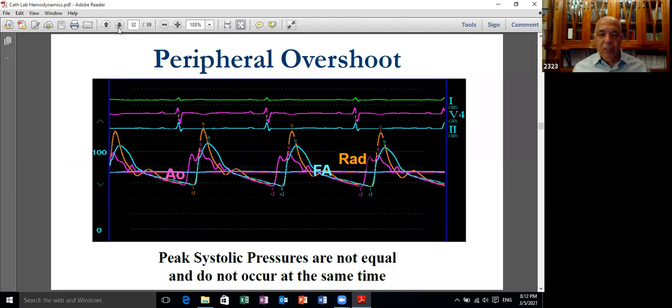Now, it's important to realize that in measuring the arterial pressure, you can measure it in the central aorta, here in pink color, and you can measure it in the peripheral arteries. As you go more peripheral, the arterial pulsation changes in two ways. It gets higher and it gets narrower. Remember that the radial pulse is distal to the femoral pulse. If you put your hand by your side, definitely the radial artery will be further away from the heart than the femoral pulsations.